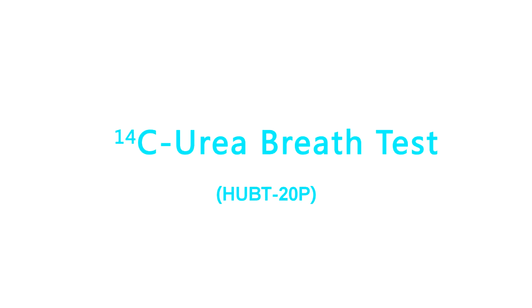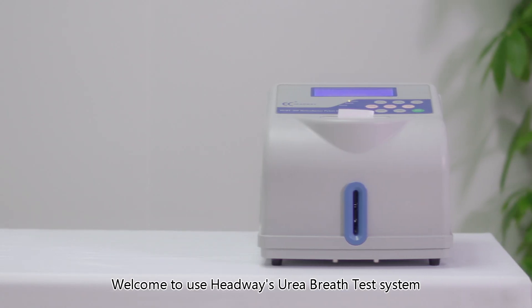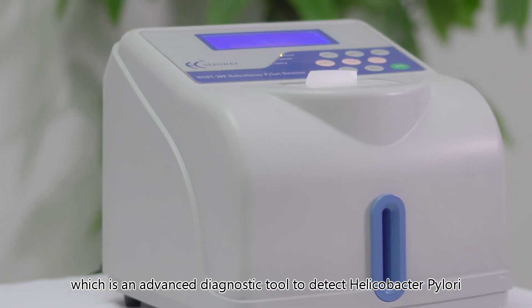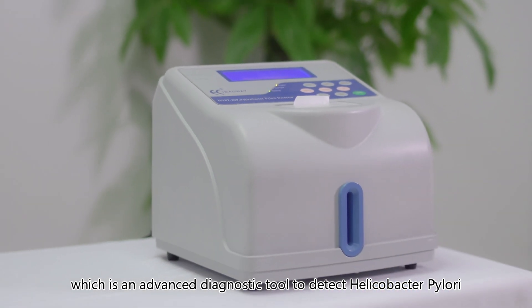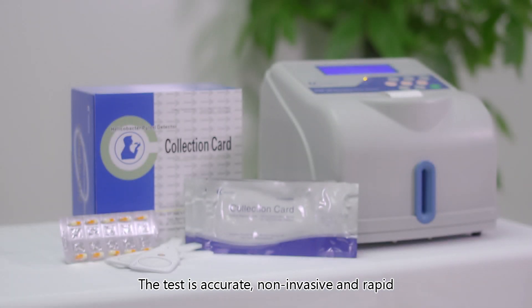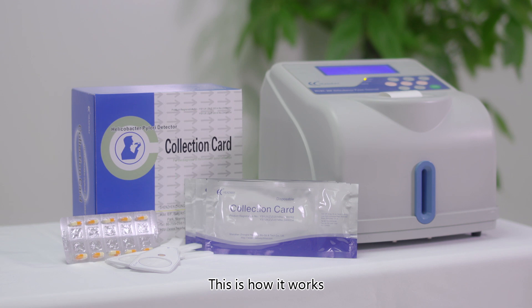Carbon-14 urea breath test, HUBT-20P. Welcome to the Headways urea breath test system, which is an advanced diagnostic tool to detect Helicobacter pylori. The test is accurate, non-invasive, and rapid. This is how it works.